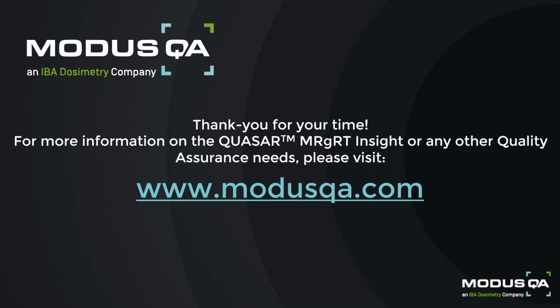Great, thank you. Regarding the film insert, what is the purpose for the film in this case? What about the film analysis and calibration? Does your software have an option to calibrate and analyze the film? Sorry, that's a several-part question. So good. I love several part questions.